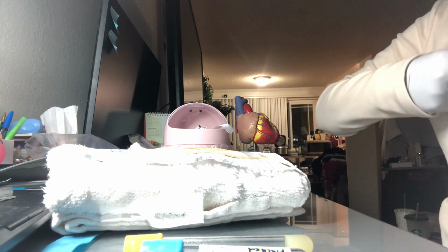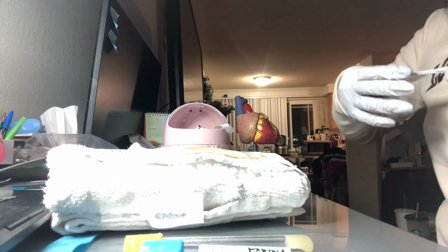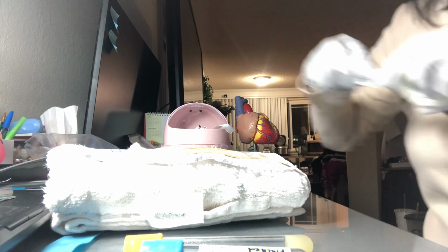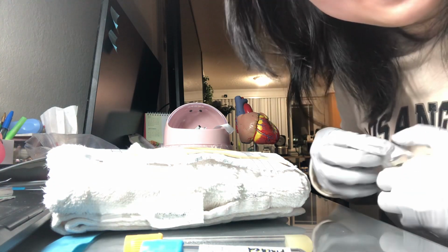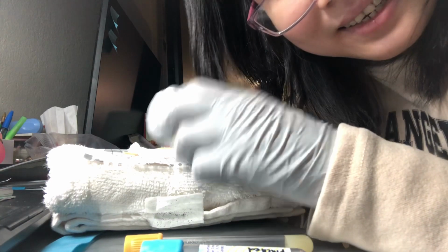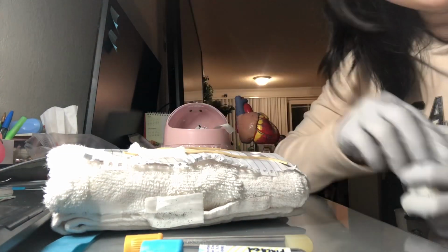This is a bit clumpy, but this is how you want it to be done. Sorry about this. With the medical tape. Thank you.